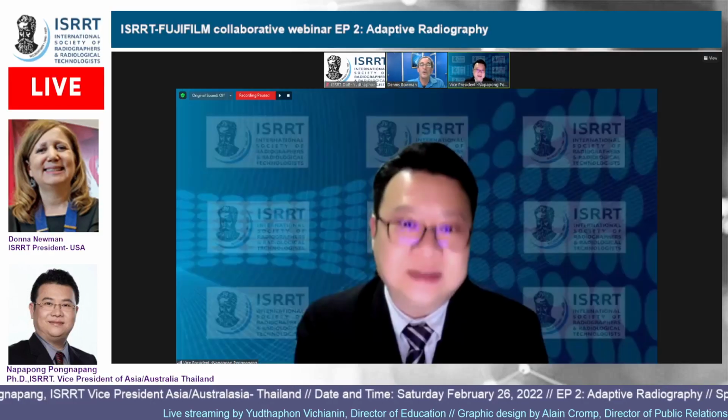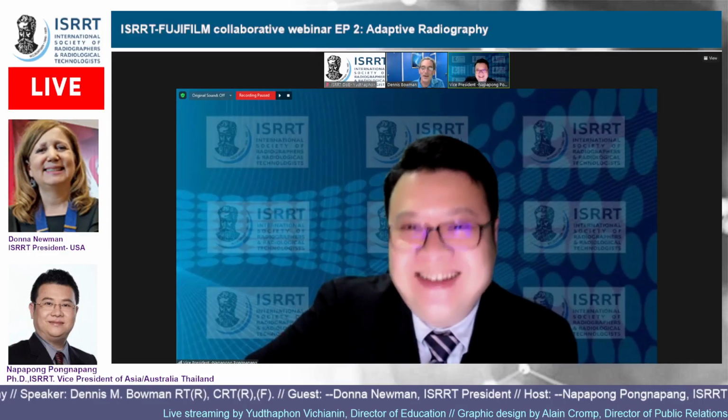But one of the things I found, at least in California, is that a lot of people would go out and fix it and do another one, even though the first one was good enough. It wasn't great, it wasn't anything you would brag about, but it was a passable image. They just realized, hey, in 15 seconds I can make a perfect image, which you can, but now you are double radiating your patient. So it's not the whole ALARA thought, where we use as low a dose as we can, because you've just done a second one. So I would say that.